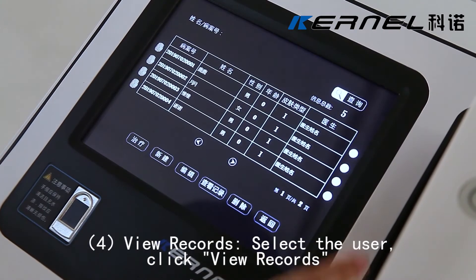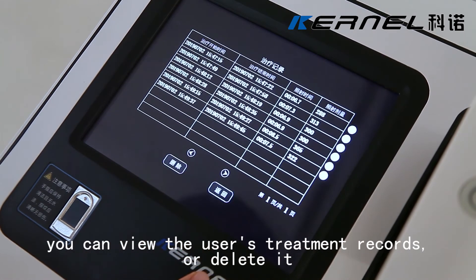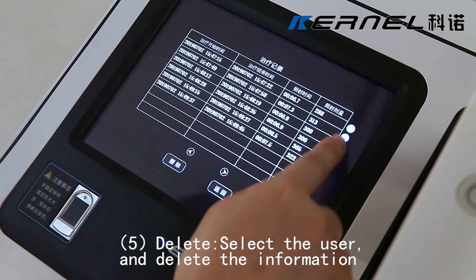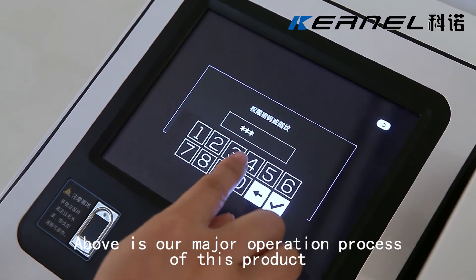To view records, select the user and click View Records — you can view the user's treatment records or delete them. To delete, select the user and delete the information. Above is our major operation process of this product.